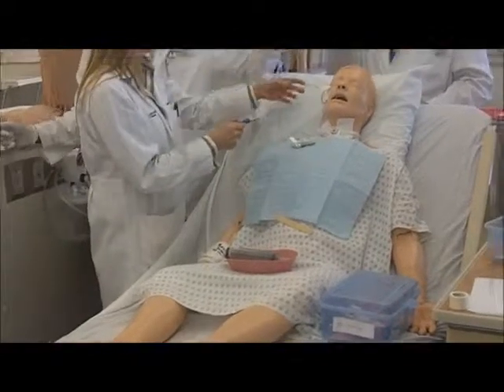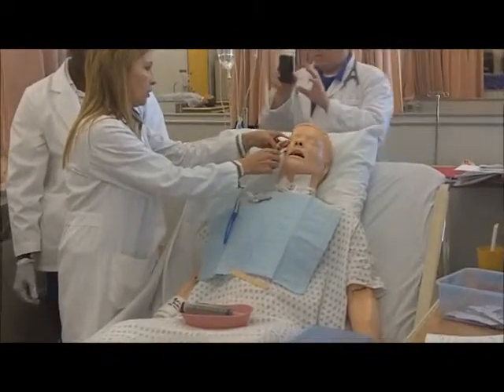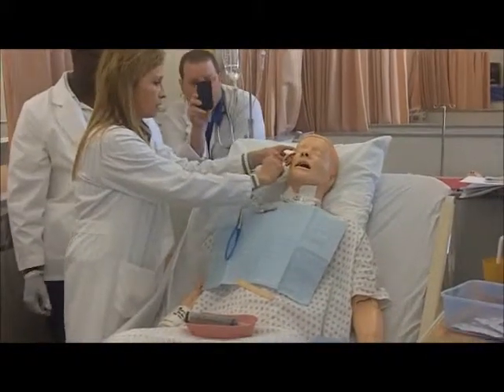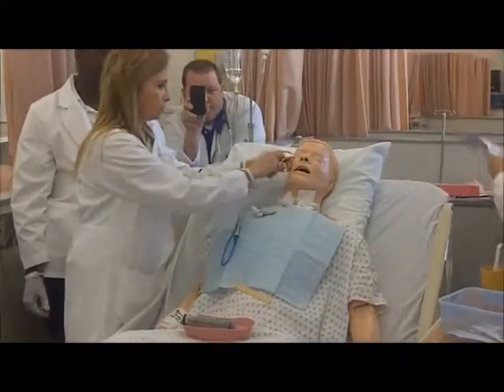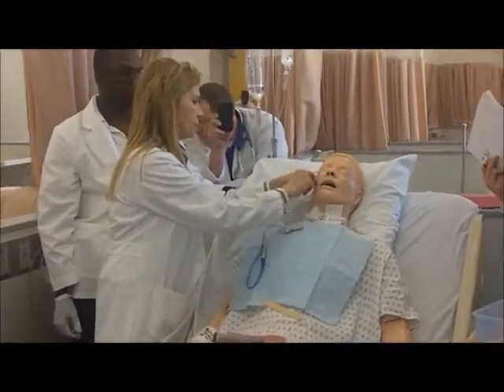What do we do next? You're going to secure it permanently? Well, what we're going to do is use his benzoin, tincture of benzoin. You want me to open this? Yes, please.